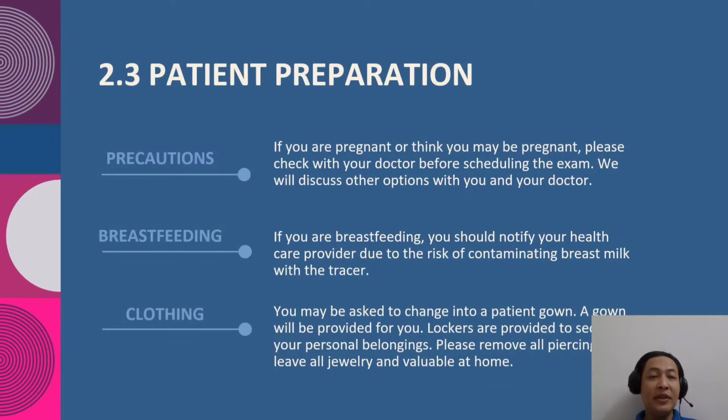Okay, the next topic is patient preparation for performing the examination. One is a precaution. If you are pregnant or think you may be pregnant, please check with your doctor before scheduling the exam. We will discuss other options with you and your doctor. Breastfeeding: if you are breastfeeding, you should notify your healthcare provider due to the risk of contaminating breast milk with the tracer.